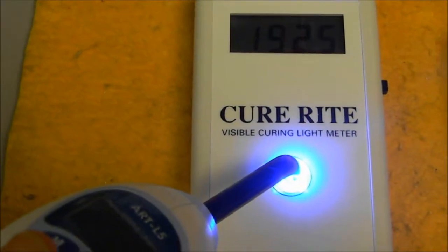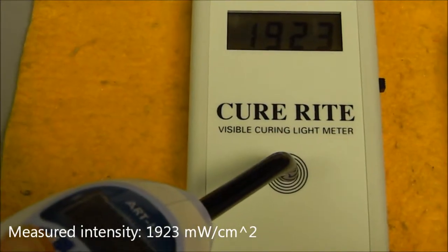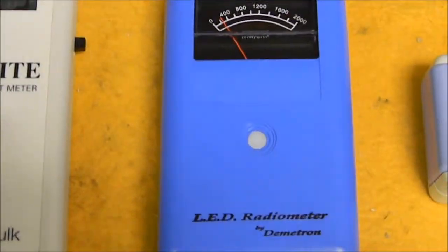We have a power measurement of 1900 milliwatts per centimeter squared. Next, we'll test the LED radiometer from Demetron.